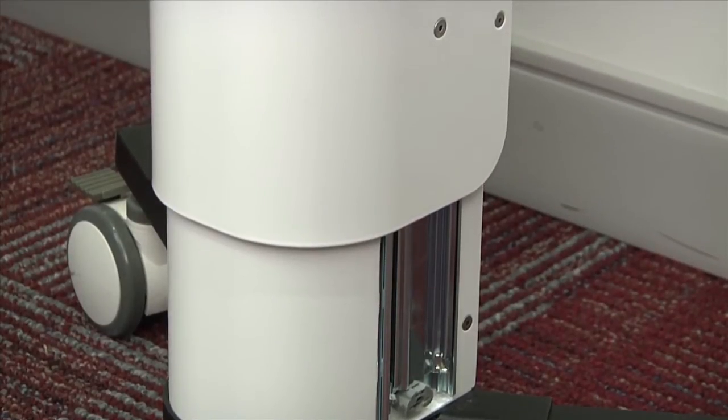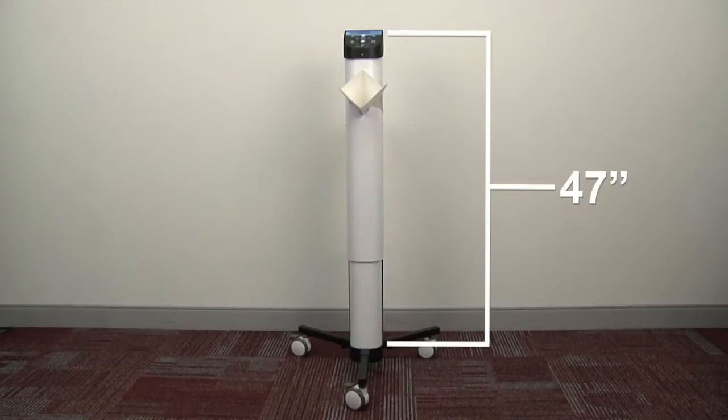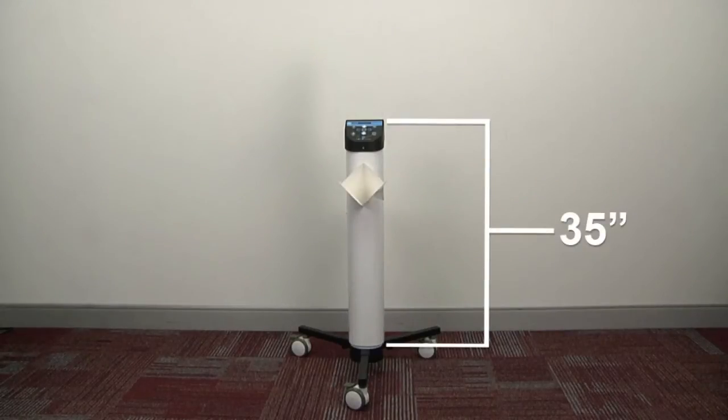The device is accommodating to a range of heights. It can extend 47 inches in height, or 35 inches when recessed.